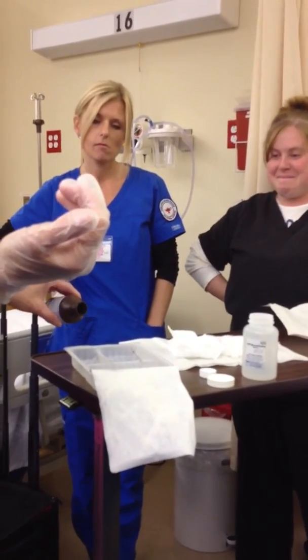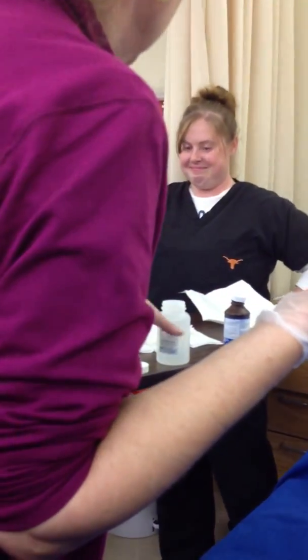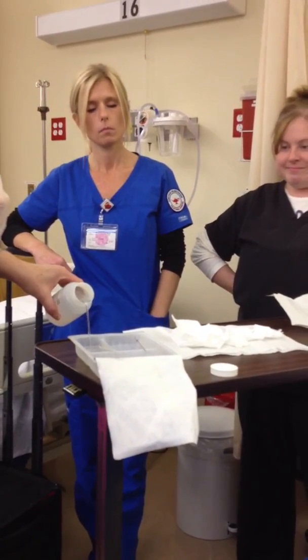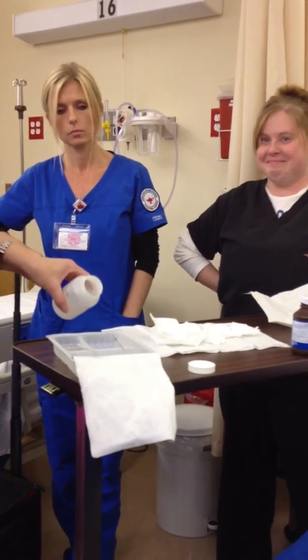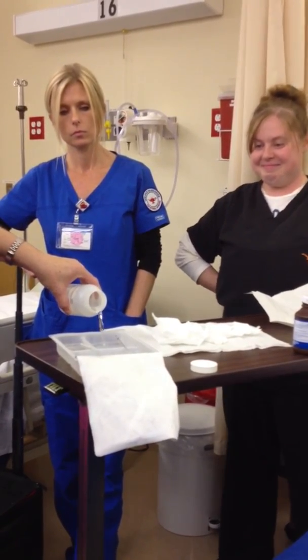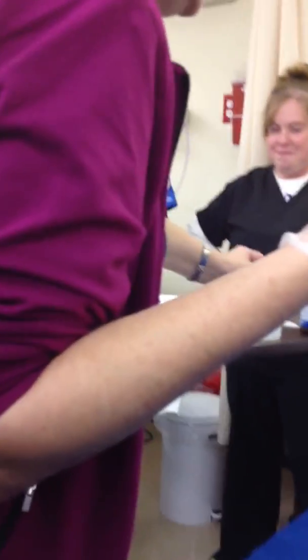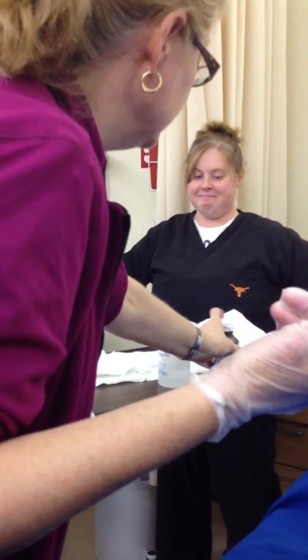And then my half and half I'm going to mix over here. This is my half and half. I'm going to make half hydrogen peroxide, half saline. And then we have to rinse the trach too, so that's going to be all saline here. Okay? And don't just pour a little bit, like 10 cc's. Don't be stingy with your liquids. These are fairly cheap liquids, because you really do need to be able to submerge.